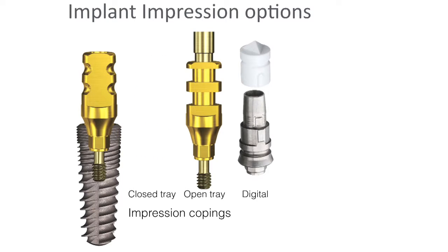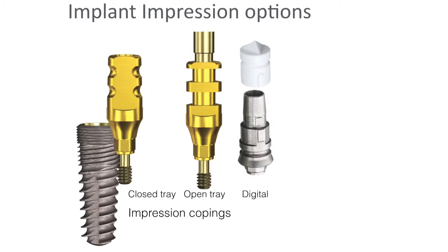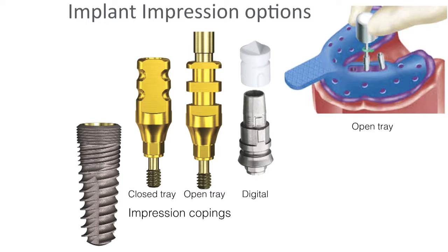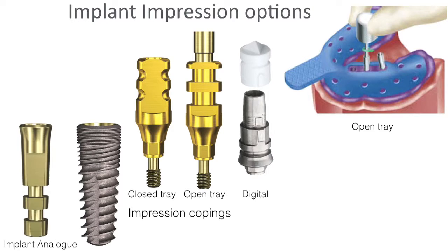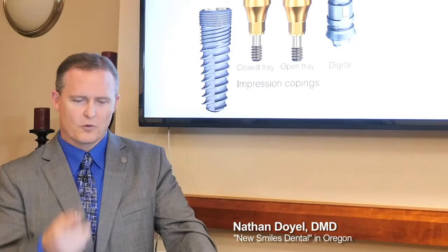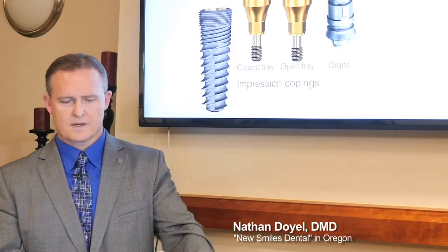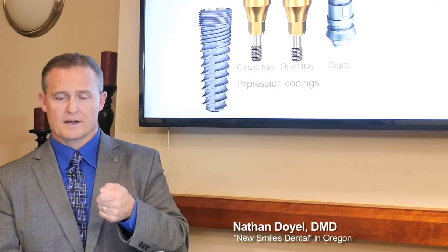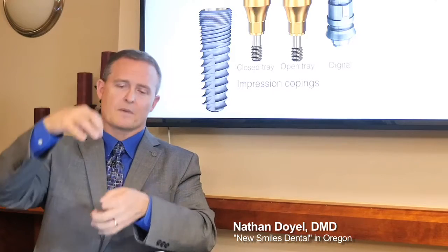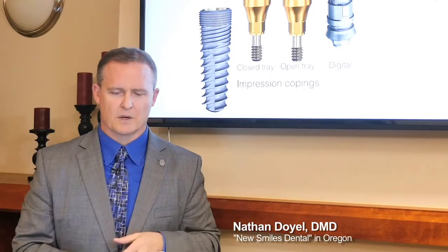All right, implant impressions. So when you're taking your impressions, if you haven't done a restorative implant yet, there's two options you have. You have a closed tray or you have an open tray. Open tray, you have to cut a little space for your coping to stick through so that when you take your impression, you can unscrew it while it's all set up and you pull the whole thing off. That's simply what it is.